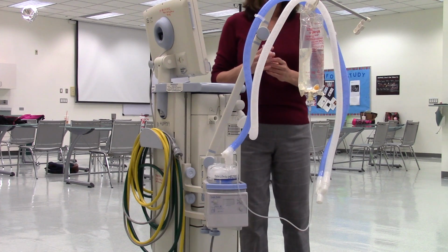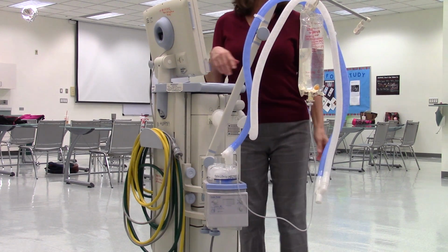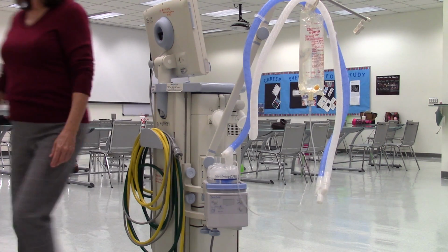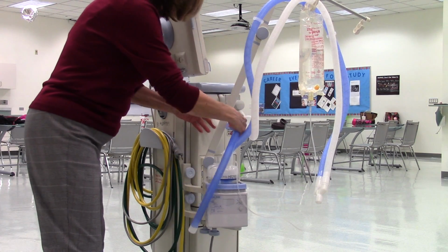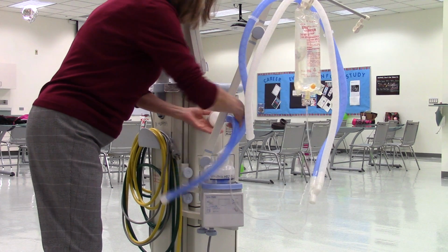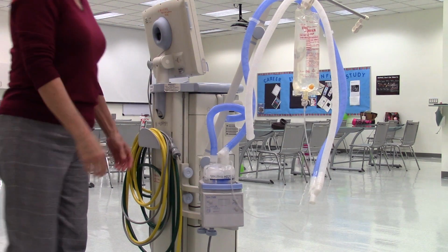Does that also go on the inspiratory? Yes. So it says, use 12 to 18 inches of large bore tubing and connect the inspiratory port on the ventilator to the humidifier. Okay, so we've got our 18 inches of tubing. We'll go from the inspiratory port on the ventilator to the humidifier.